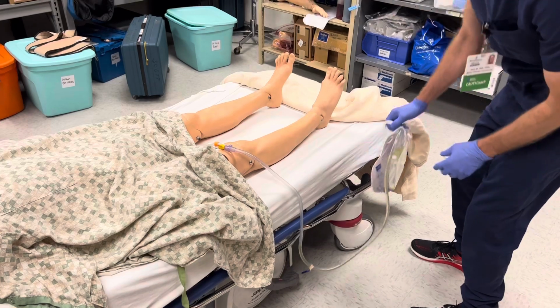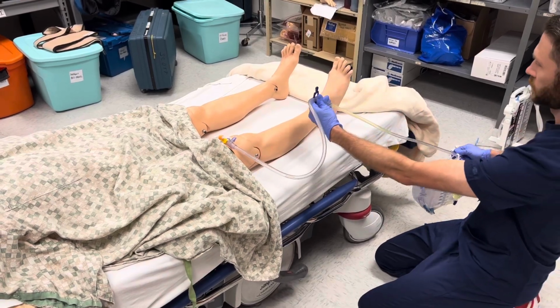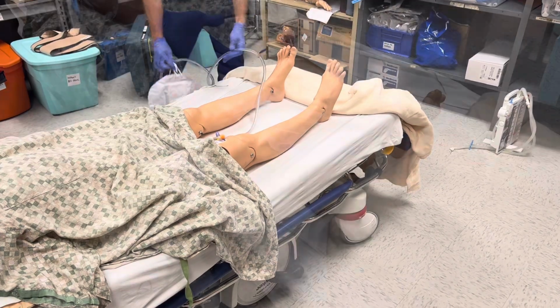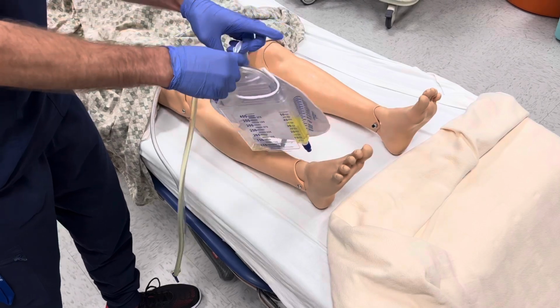These same concepts apply when repositioning a patient to prevent backflow of urine into the bladder. First, clear the drainage tubing of urine and then avoid lifting the drainage bag above the level of the bladder. The drainage bag should hang below the level of the bladder at all times, including during transport.